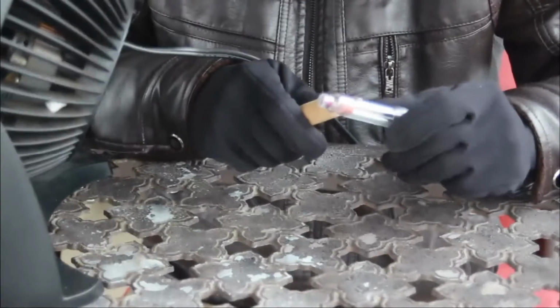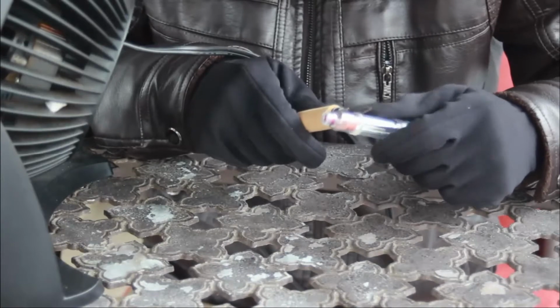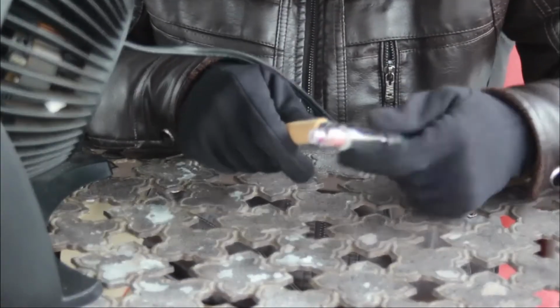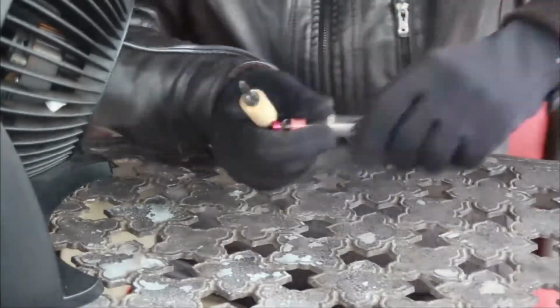Now, you could try this at home with something like scissors or a knife, but I recommend using a hot knife that you can actually melt it with, because if you try to apply too much pressure to this, you might end up breaking the glass vial inside, and that'd be a lot of mess. It might hurt you. You want to avoid that.